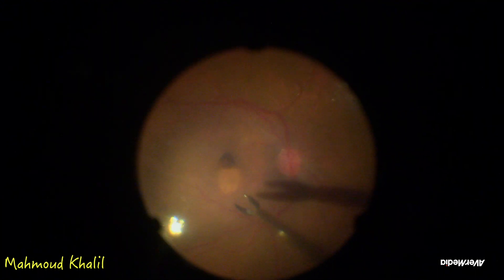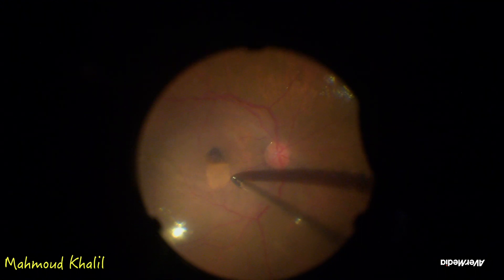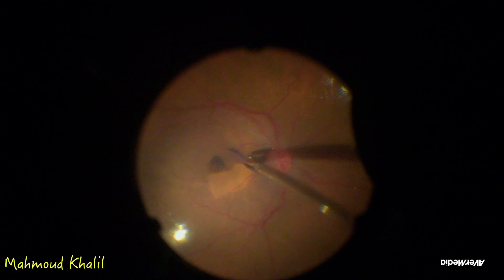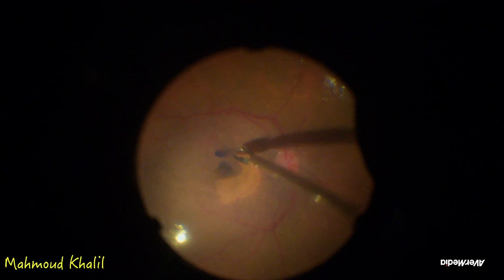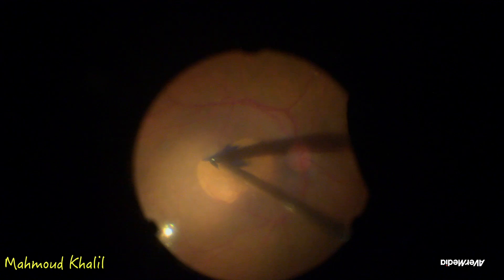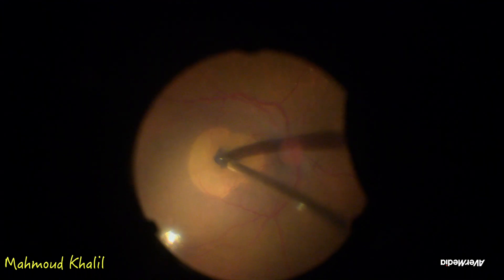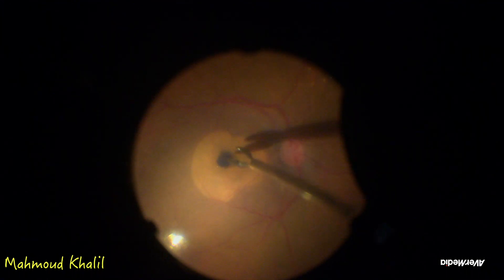This video illustrates the inverted ILM flap technique, starting to peel the ILM at a point about two disc diameters from the center of the macula, peeling all around and keeping the ILM attached at the margin. Keeping this attachment helps to prevent ILM flap loss.